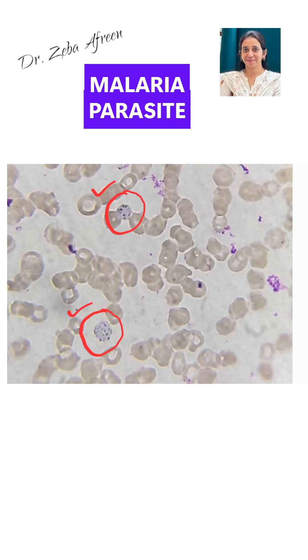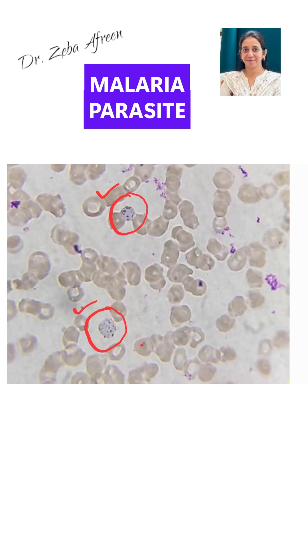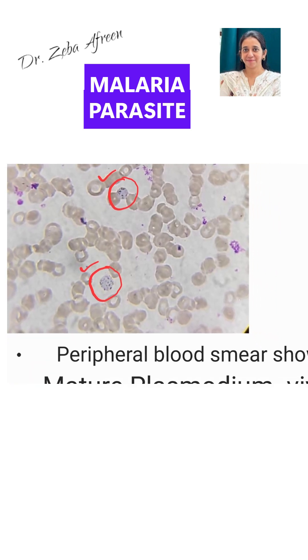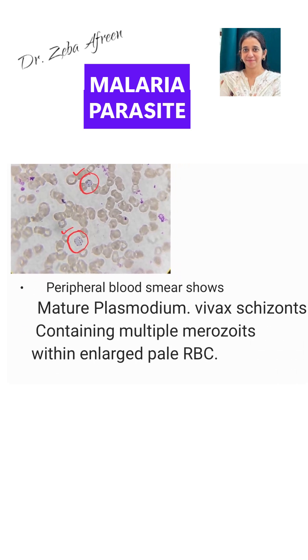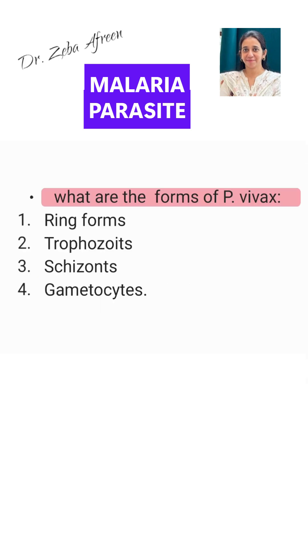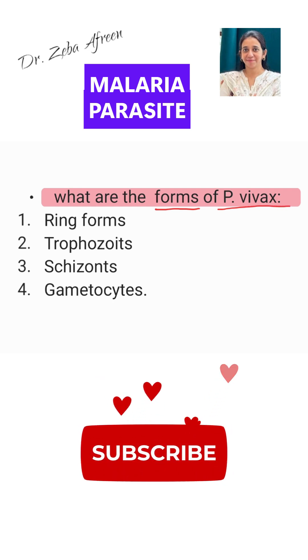The RBCs appear enlarged and have pale cytoplasm. The reason the RBCs are enlarged is because the malaria parasite attacks only the immature RBCs, and immature RBCs are larger than normal mature RBCs. Now, what are the different forms of Plasmodium vivax that we can see on a peripheral blood smear?